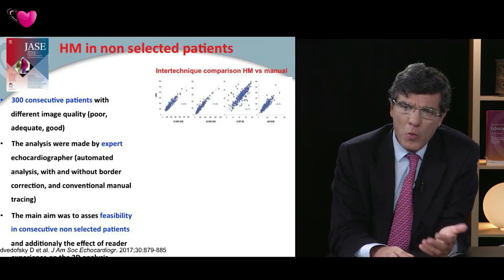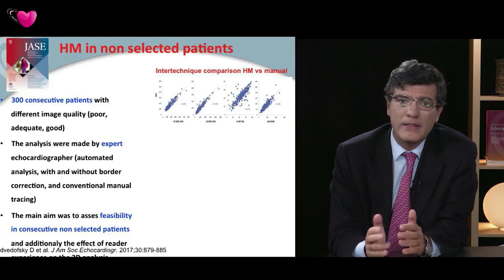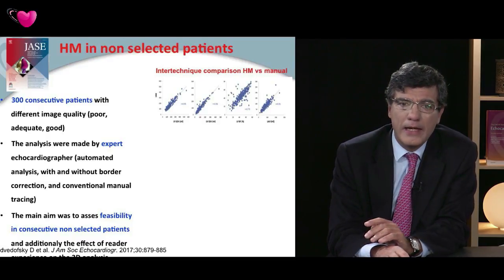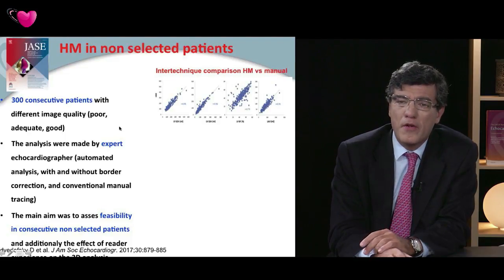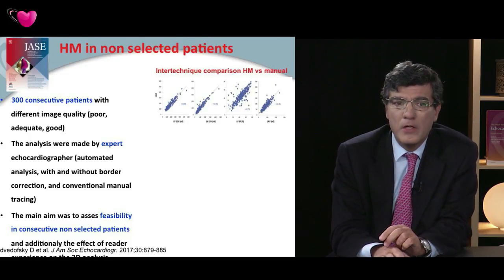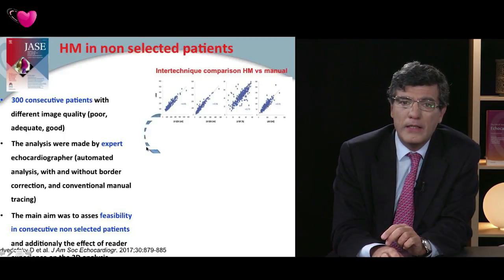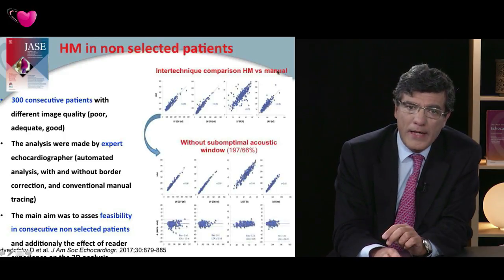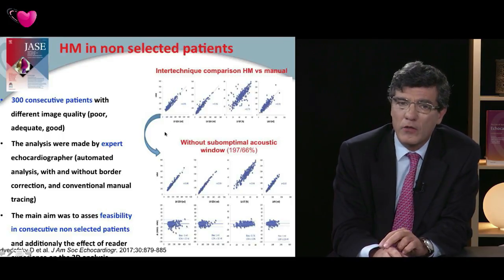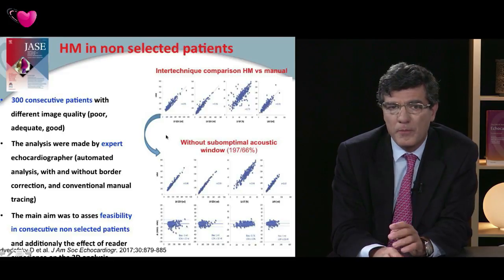So what happens if we don't select the patient? Do we have information in non-selected patients? And this is, again, a very nice study showing 300 consecutive patients that were admitted to the hospital, to the echo lab, just to do, for different reasons, an echo study. Well, in fact, here you can see that the correlation of the different variables with the heart model is excellent. And in fact, when we only analyze the patients without suboptimal acoustic window, the correlation is almost perfect.